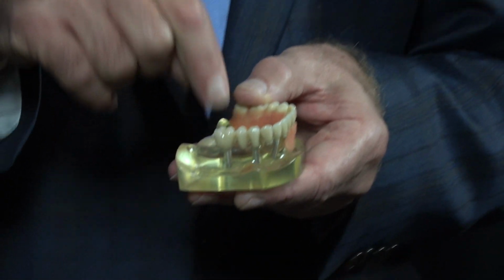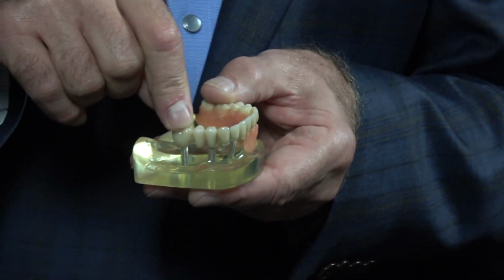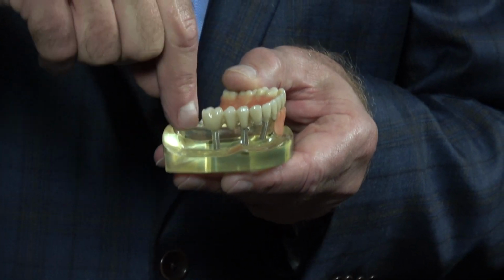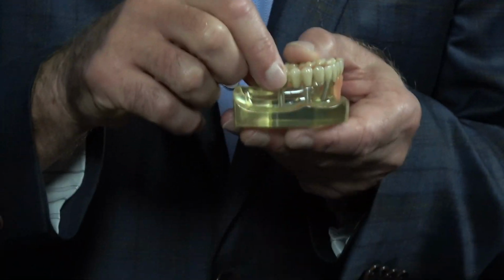The abutment is always screwed into the implant. The crown can either be screwed into the abutment and the implant, or it can be cemented on the abutment.